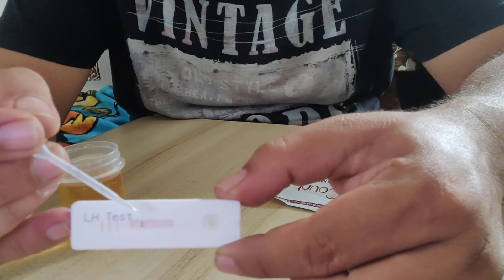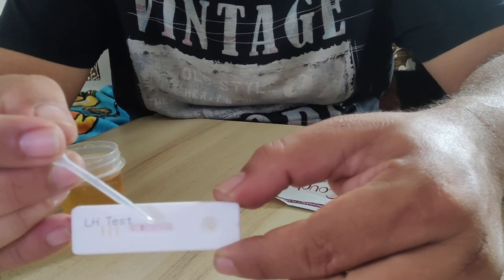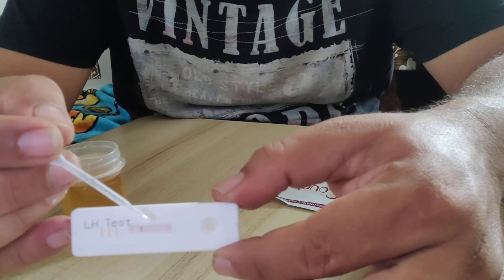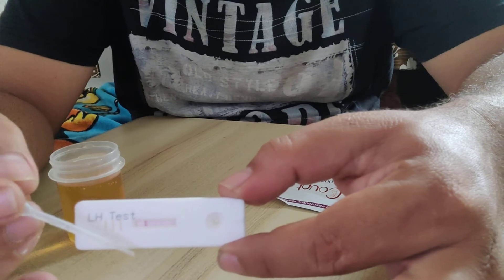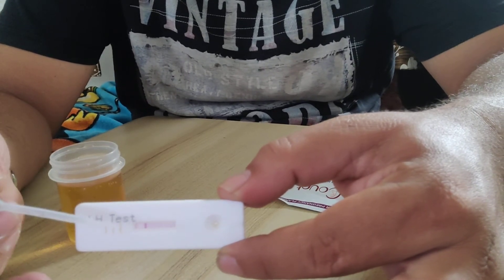If a single band appears, the result is negative. If two bands appear, congratulations — you are positive! There is a high chance of getting pregnant. A single band does not indicate pregnancy, so you can repeat the test.